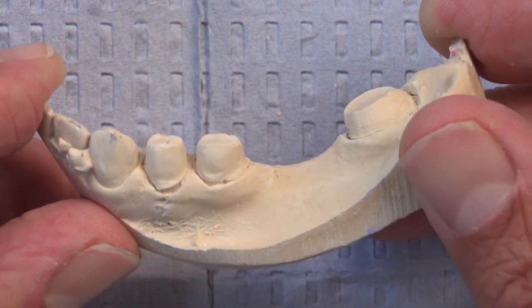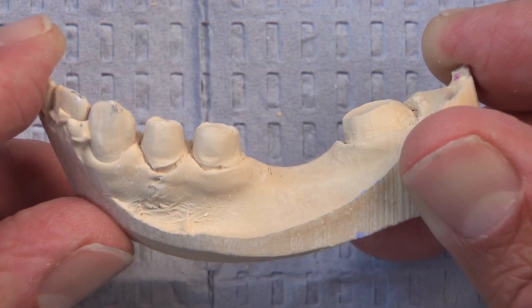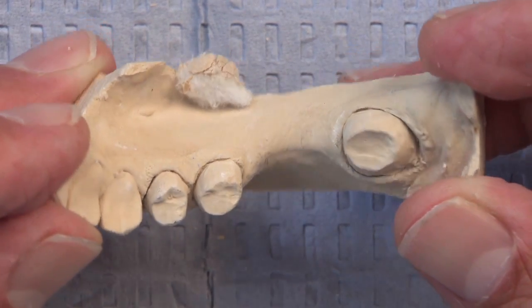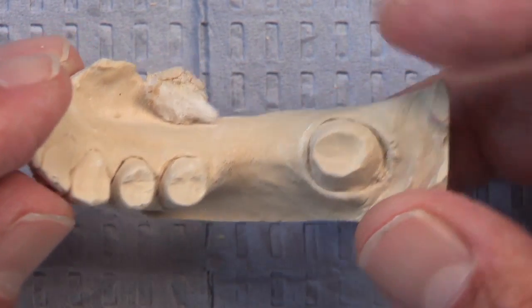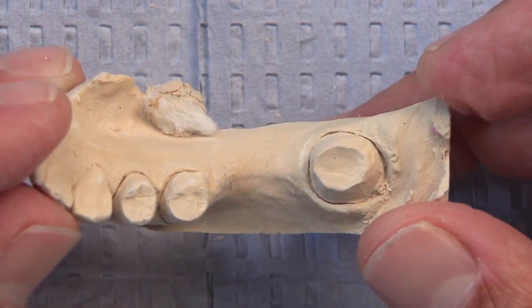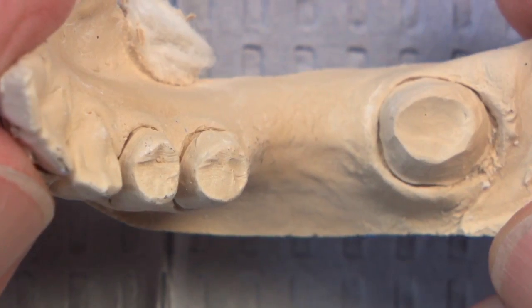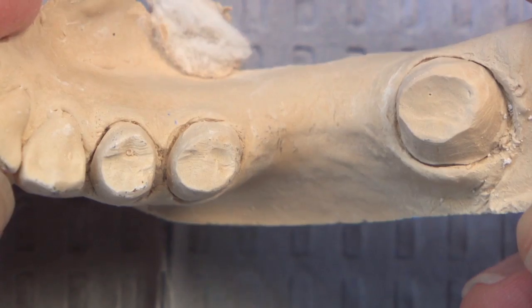We might have had a couple abfraction lesions right there on the facial of the 2 bicuspids. But we can see that we're probably under-reduced on the occlusal, and we're definitely under-reduced on the mesial of that wisdom tooth if in fact we want this bridge to draw. So let's take a look at the mounted models on the articulator.